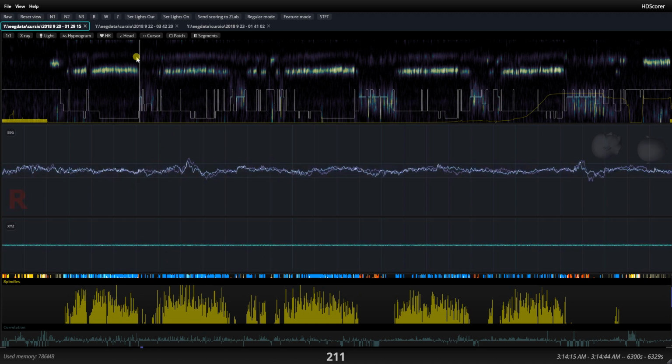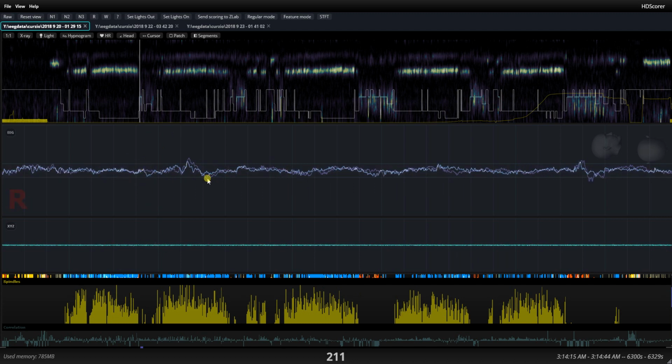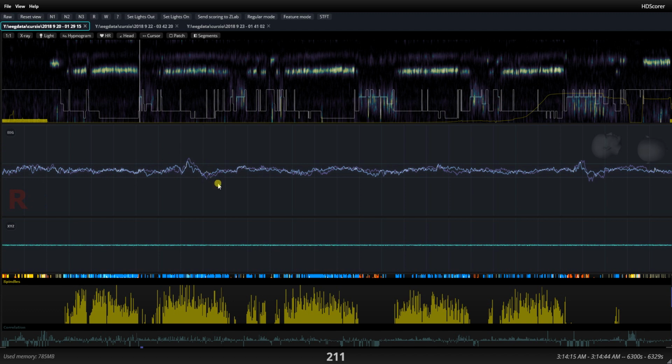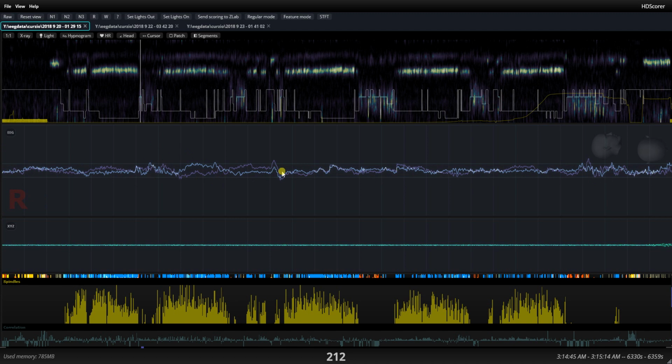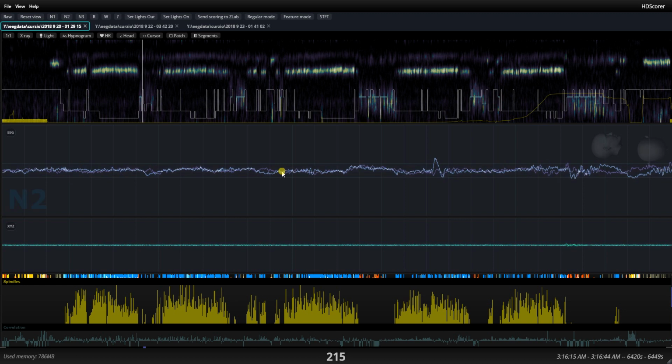I mean, you could call these K complexes, but on the other hand, I see that this is an eye movement, and this could be an up and down eye movement. The left and right eye movement look like this, and the up down eye movements, they look like this. It seems too fat and short to be a K complex. This is very probably up and down eye movement, so it's probably correct that this is REM. If I'm not sure, I don't expect any algorithm to also be sure. Anyway, then we got N2.